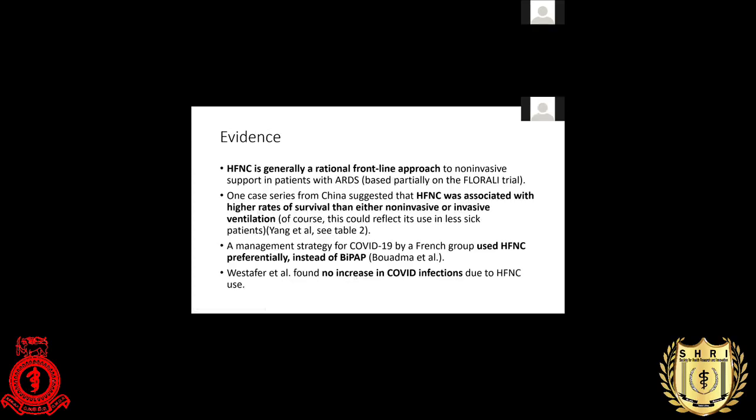When we discuss evidence, there is a lot of evidence to support the use of high flow nasal cannula in COVID pneumonia patients as an early treatment strategy.